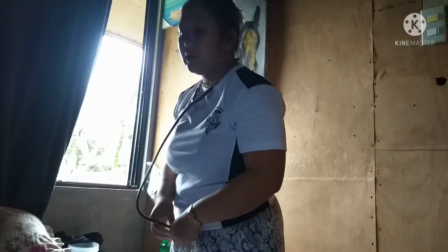Wrap the cuff smoothly and snugly around the arm with the end of the cuff secured. A twisted cuff or drooping could produce an inaccurate reading. Use the fingertips to feel a strong pulsation in the antecubital space. An accurate blood pressure reading is possible when the stethoscope is directly over the artery.